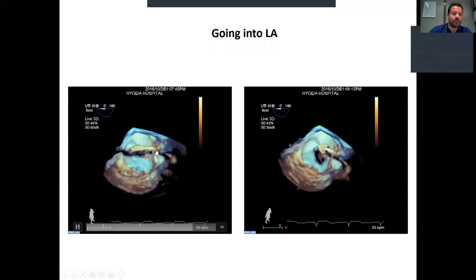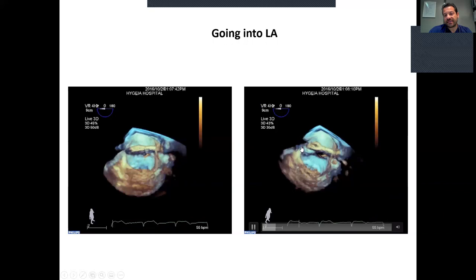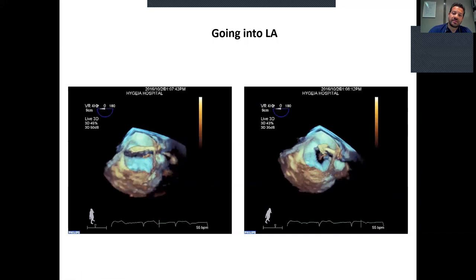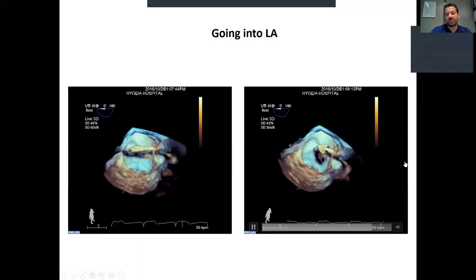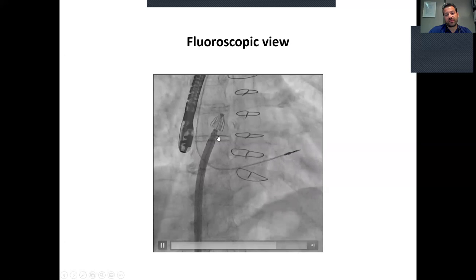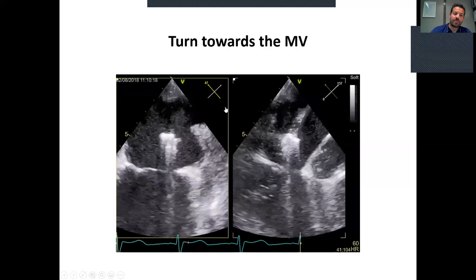The Pascal comes elongated into the left atrium, as you can see in the left image. Then we retract the paddles back, as seen in the right image. This move is important to gain space and not touch the free wall of the left atrium or the Coumadin ridge when we turn to the mitral valve. This is the fluoroscopic view of the Pascal system delivered from the inferior vena cava to the right atrium, with the device in the left atrium and paddles retracted.